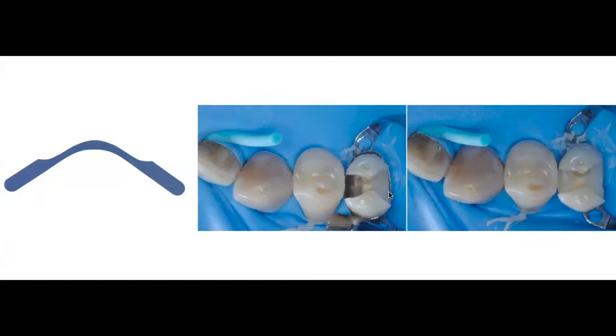Now, in the case that I'm sharing with you right now, you can see that I'm using one of these modified bands. Because they've been modified, they've been cut, as you can see here on the occlusal end. These bands are very short from the gingival towards the occlusal, maybe a couple of millimeters, which in turn gives you the idea of where the increment should be located and how deep that increment should be.